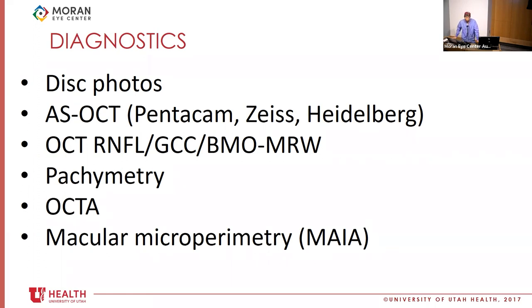The advantage of microperimetry is it has gaze tracking, so it's easier for patients to continue with the test rather than having to be looking across and having a lot of fixation losses. So that is one advantage. So it's a research tool. It's easy to upload into Access if you need to look at those images, but it's not something that we currently have access to at every location, mainly here at the Marantz as well as our Mid-Valley location.